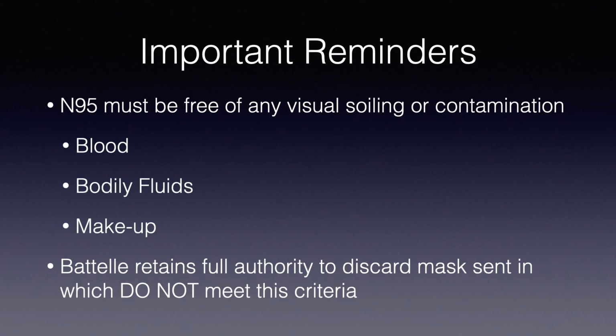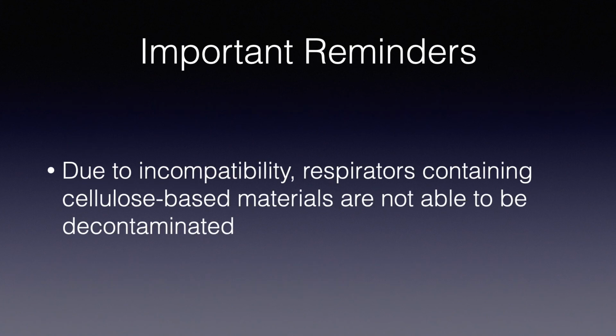Before we get into the steps on how to sign up, there are a few important reminders that you must follow. All N95s must be free of any visual soiling or contamination. This includes blood, bodily fluids, and makeup. Please also remember that Battelle retains full authority to discard any mask sent in which does not meet this criteria. One additional important reminder is that due to the incompatibility with the process, respirators containing cellulose-based materials are not able to be decontaminated through this system.